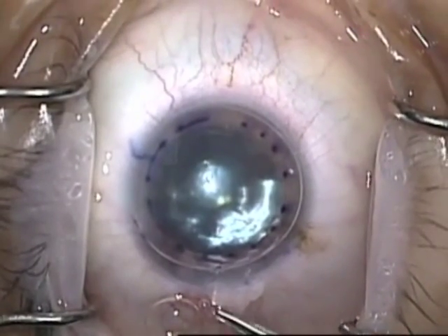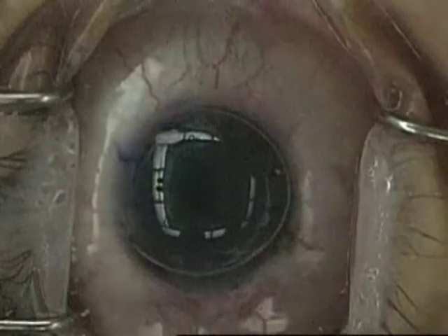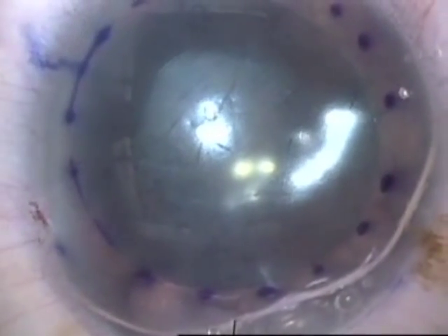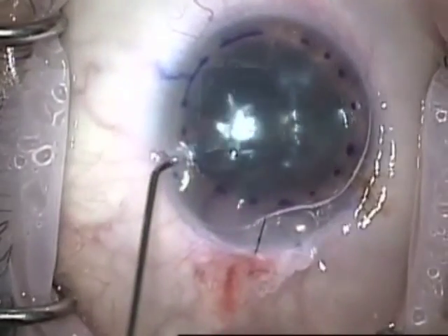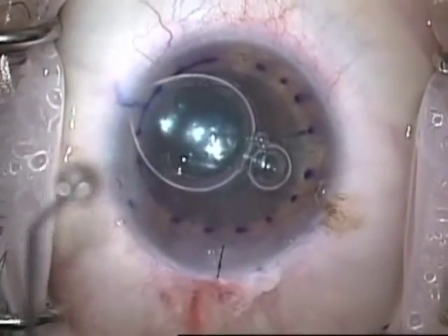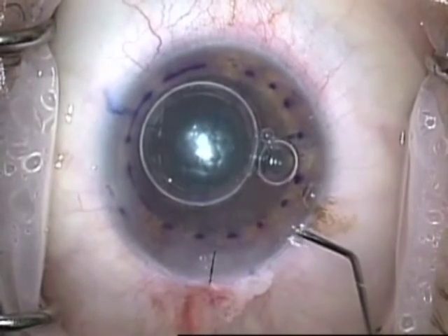The SF6 stays around longer than air and gives the graft a little more support. I place a suture and do a 10-minute timeout to allow the graft to adhere. You can see there's very minimal endothelial damage. Then I adjust the size of the air bubble — removing air, exchanging it with balanced salt solution to get a freely mobile bubble, then adding back some air — and that's the end of the case.